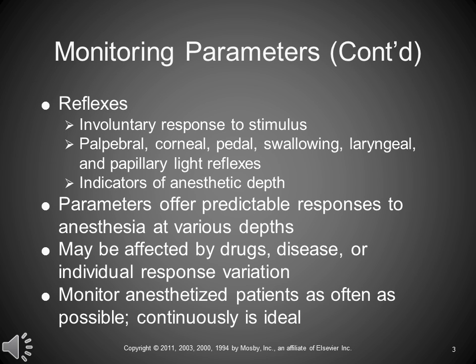We are going to monitor that anesthetized patient as often as possible. Continuously is ideal. It's pretty much mandatory if you're really going to be doing a good job. Generally, I try to set students up on a 5-minute cycle. 5-minute cycle of measuring vitals, 5-minute cycle of reflexes, 5-minute cycle of checking machines and what's going on, 5 minutes of making sure we have a ventilation, and then at the end of that 5-minute cycle, it's time to do it all over again, having included in there writing all the things that you found in the anesthetic record.